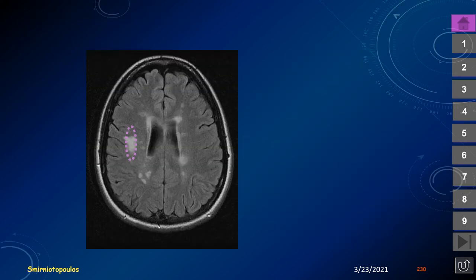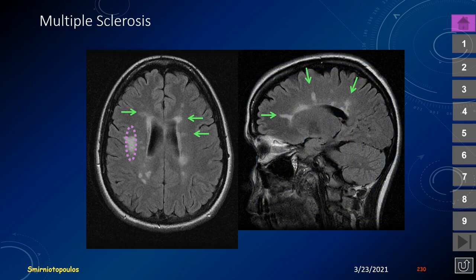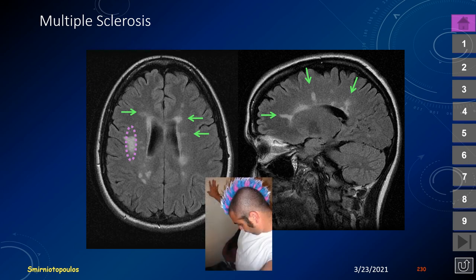Regarding white matter disease in the cerebral hemispheres, multiple sclerosis is the most common demyelinating disease. The classic appearance is ovoid areas of demyelination surrounding small venous structures — the central vein sign — identifiable on susceptibility-weighted imaging. The long axis of the oval is perpendicular to the ventricular margin. Always look at the callosal-septal interface for signal abnormality at the undersurface of the corpus callosum.